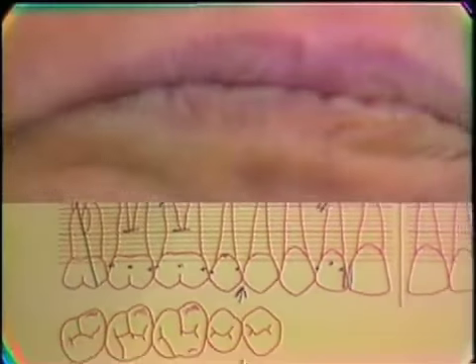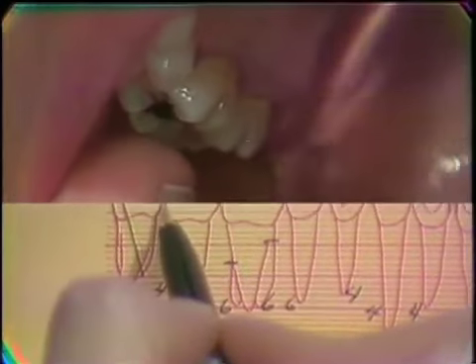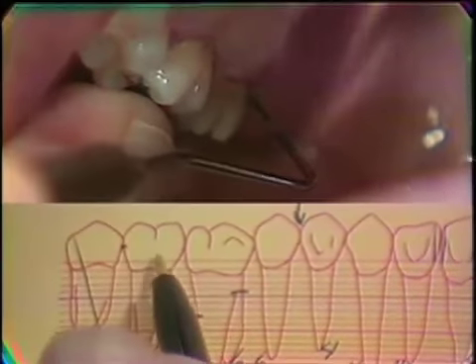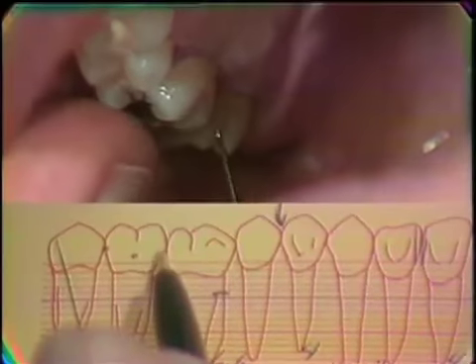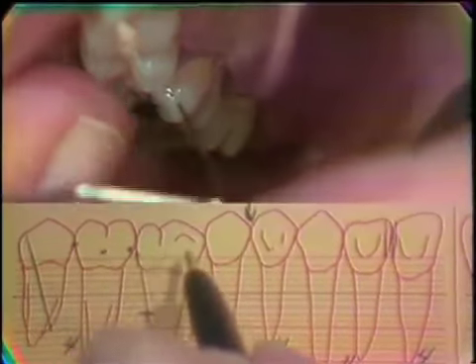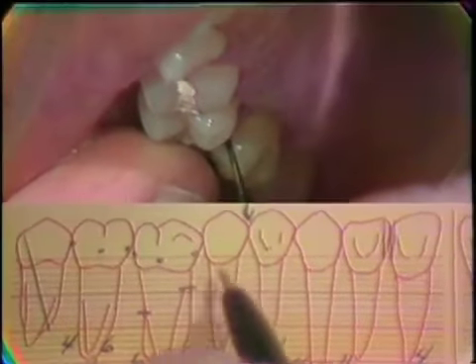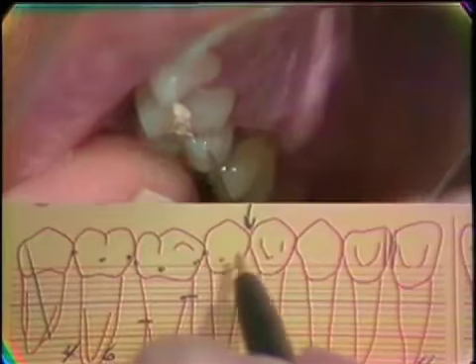The lingual of tooth number 2. Turn your head a little bit this way, please. Two, 2, 2. The lingual of tooth number 3. 2, 1, 3. Number 4. 3, 2, 2.